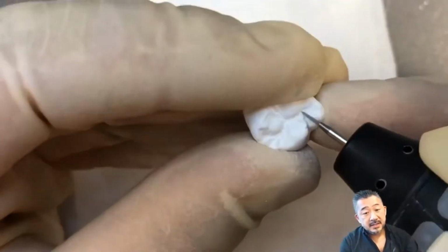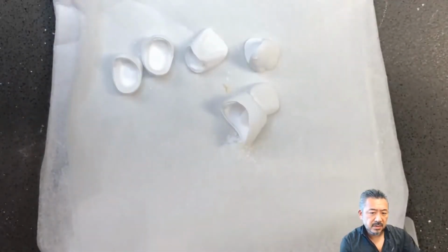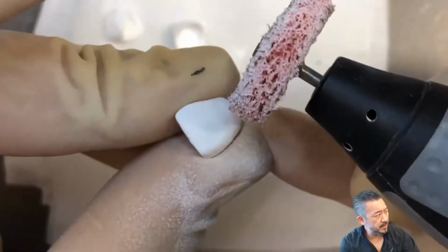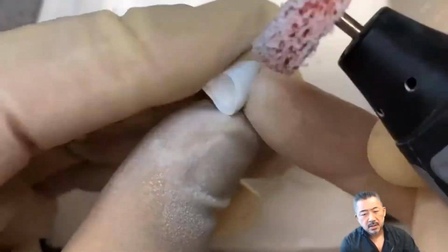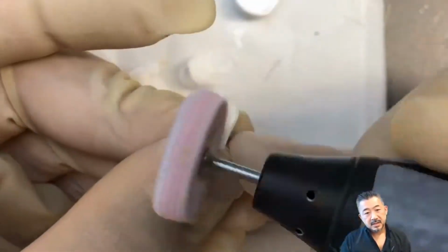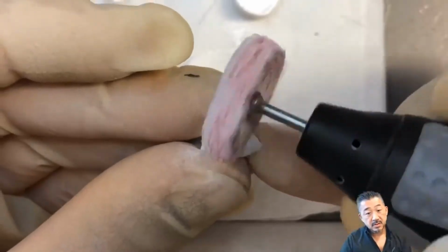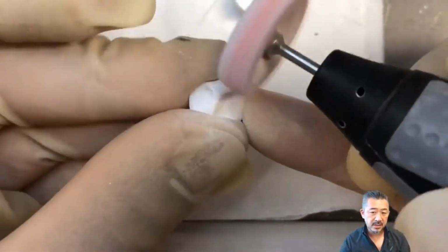And next, if necessary, use a pink polishing pad for zirconia to lightly and smoothly go over the crown surface. So again, don't touch the margin. This is always done from the incisor edge towards the margin.